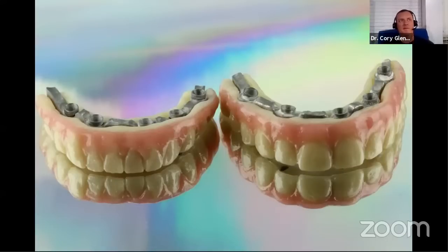A thing to be aware of with the Form 3B is that there's a different build plate that you're supposed to use for these resins. So if you're using the permanent crown and bridge resin, there's a stainless steel build plate. And I'm not 100% sure on this, but as I understand it, apparently these resins, because they have so much filler in them, can actually abrade away an aluminum build plate, which is what most of them are. And so you need the stainless steel one for it to hold up in the long term of using this. But yeah, I've not really had any issues with that.